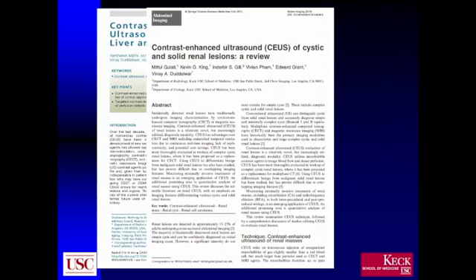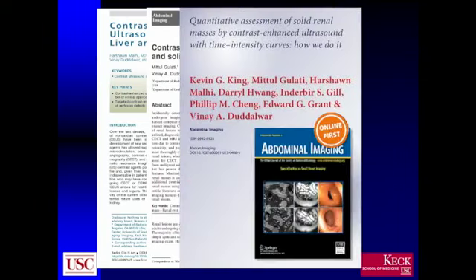It's a nice review of renal masses with contrast-enhanced ultrasound. And finally, an entire article dedicated to the use and explanation of quantitative assessment, as I briefly mentioned in some of my slides, with time intensity curves and exactly how we use it.